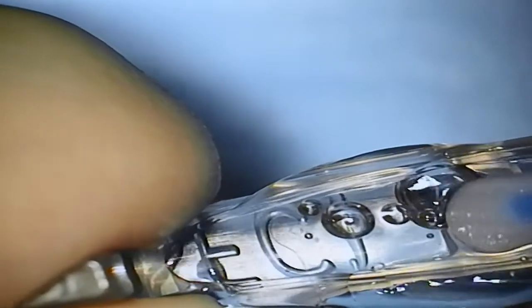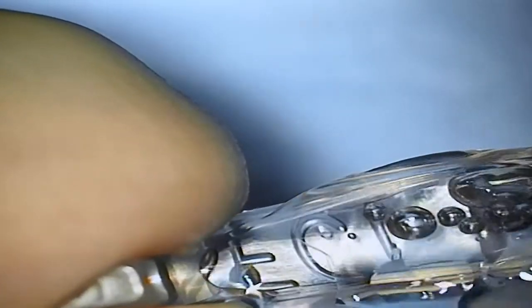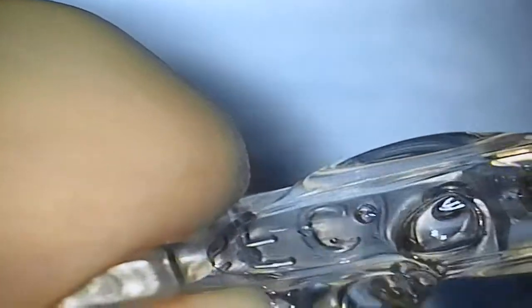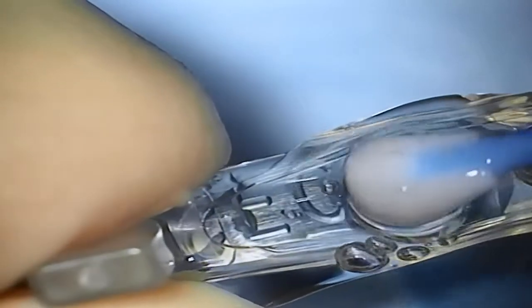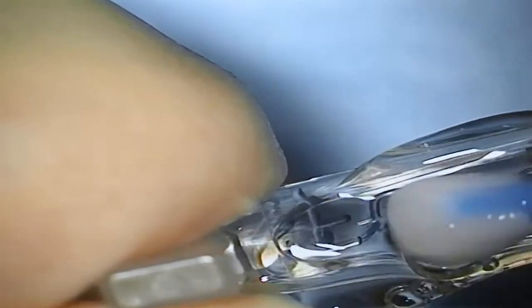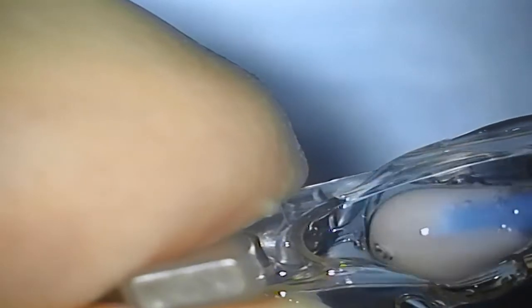We can also use the pusher itself without any metal instruments. As you can see here, with enough viscoelastic, we use this soft touch of the pusher to push the lens gradually and squeeze it without much effort into the conus of the injector. And we can also use the same movement to check the free movement of the lens.